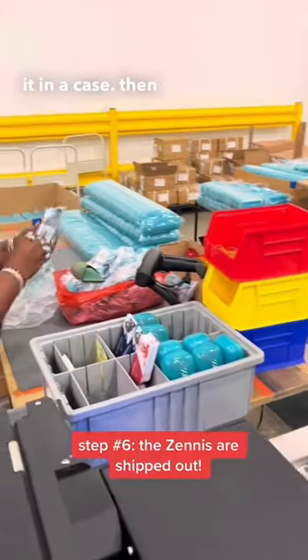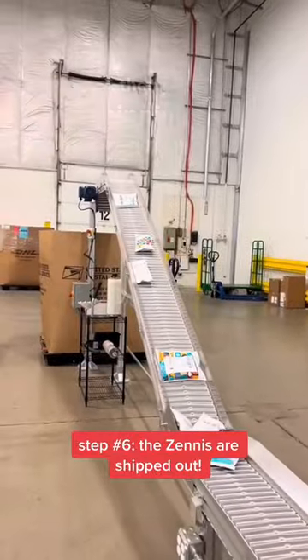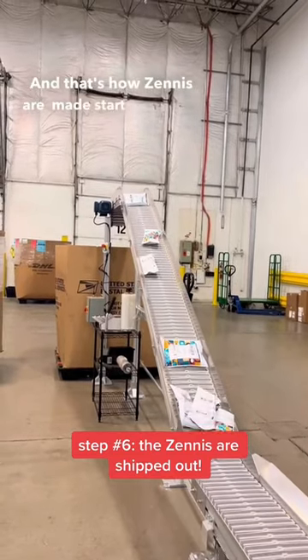And then we'll place it in a case, put it in a shipping bag and everything, and that's how Zinnies are made, start to finish.